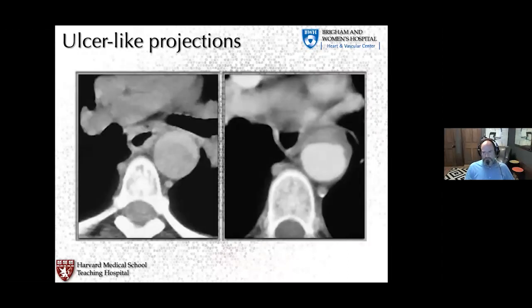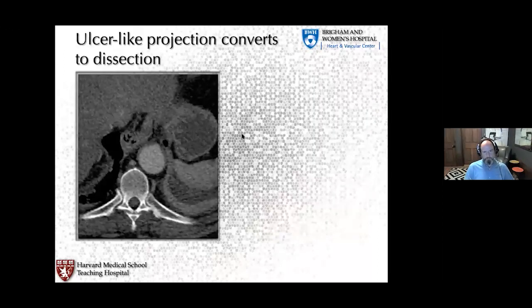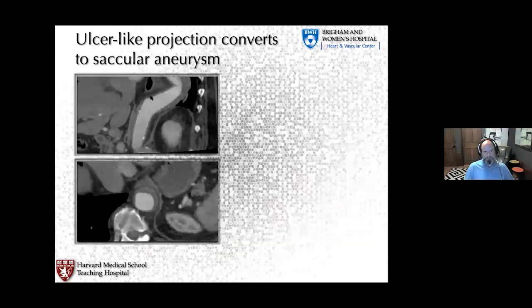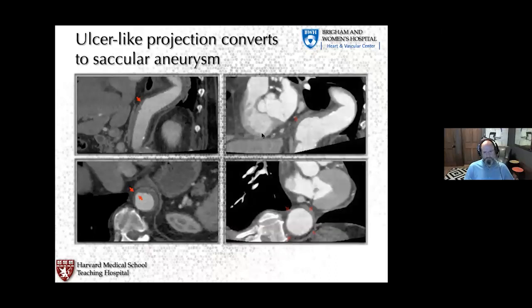Another feature of intramural hematoma is the ulcer-like projection — a focal defect in the wall representing a focal intimal dissection. This term is used specifically in the setting of IMH and is important to monitor on follow-up, as it can progress to a larger saccular aneurysm. One example shows a small ulcer-like projection that became a saccular aneurysm on follow-up.